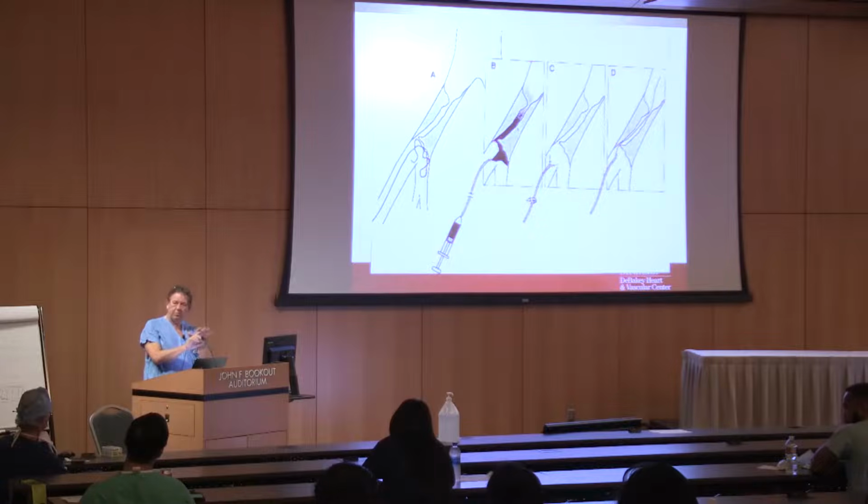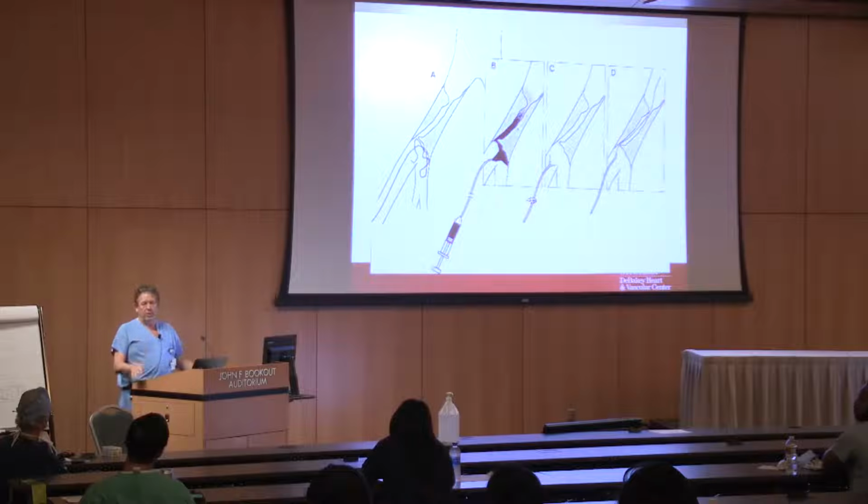But sometimes it's too dense. One of the problems with that, it gives you a nice picture, but you can't see the wire. It's so dense you can't see the wire on the catheter coming up. And so you can actually fade that down. You can control that table side by how dense it is. And people say fade it up, fade it down, okay? And sometimes you're doing it continuously. You advance the wire, fade it down, advance a little bit, bring it up, make sure it's still on the lumen. And that's the way we tend to use this.